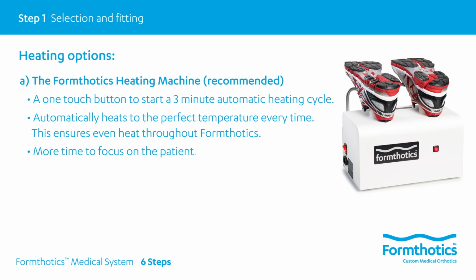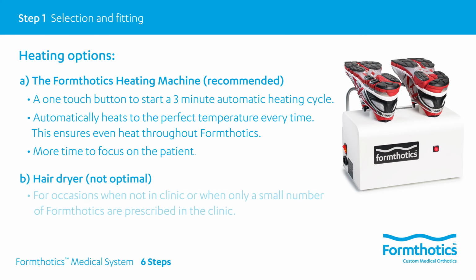More time can be spent with the patient. Why not make them a cup of coffee? A hairdryer can be used on occasions when not in the clinic or when only a small number of Formthotics are prescribed in the clinic.